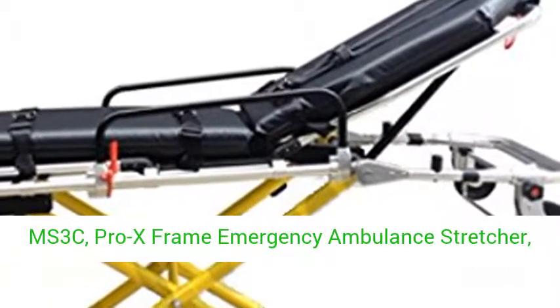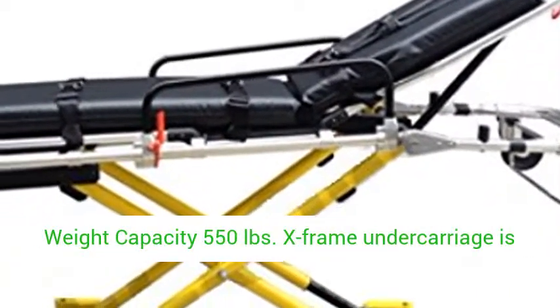MS-3C Pro X-Frame Emergency Ambulance Stretcher, weight capacity 550 pounds.